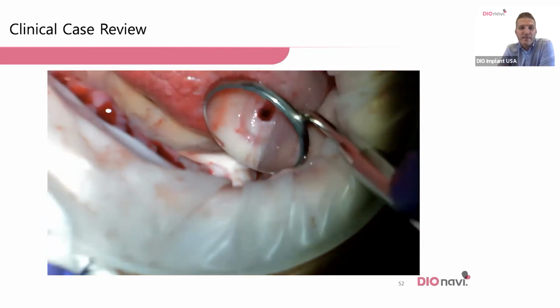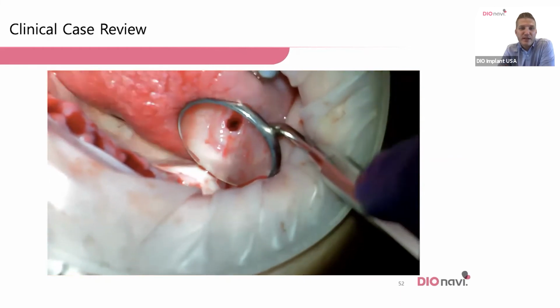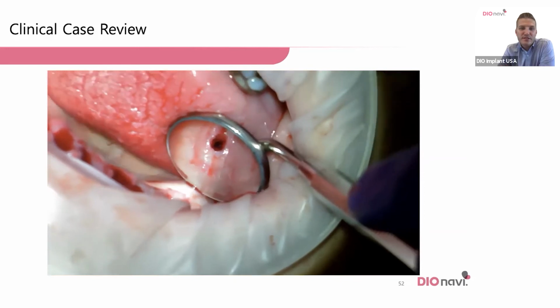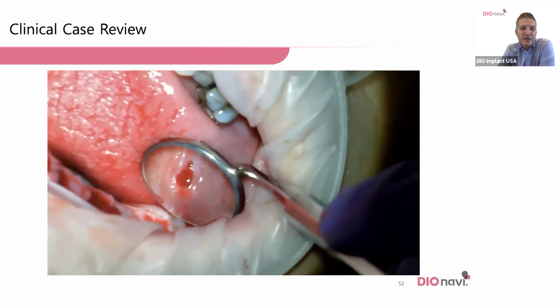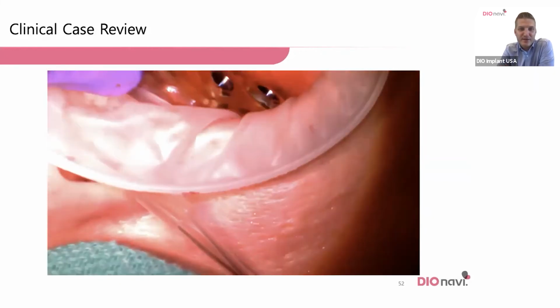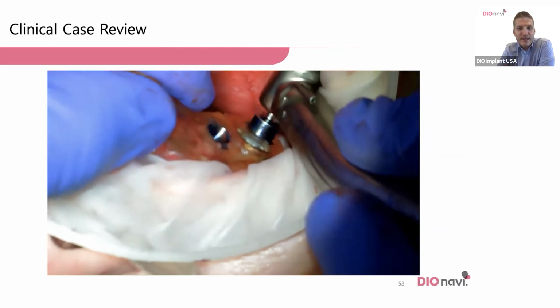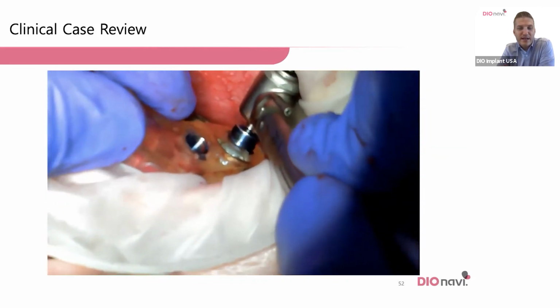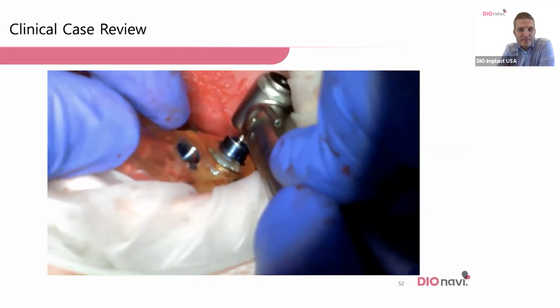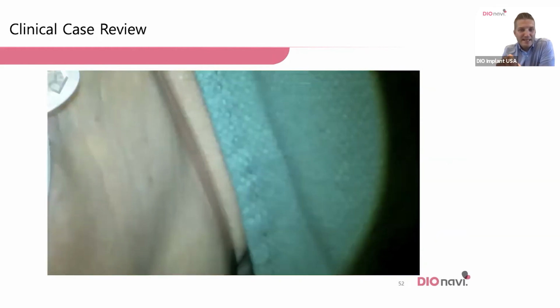Now check this out. Here's the nose test. No bubbles. I'm seeing the saline, but look at, I see the little hole. There is certainly no perforation. That's a beautiful video there to capture that. That's probably the best part of my video there. I should have stopped it there because now the rest gets a little blurry. I have to do one more drill to create even extra patency so that I can pack my bone. So I'm going to go ahead and run one more drill, and now it's even more patent at the end.